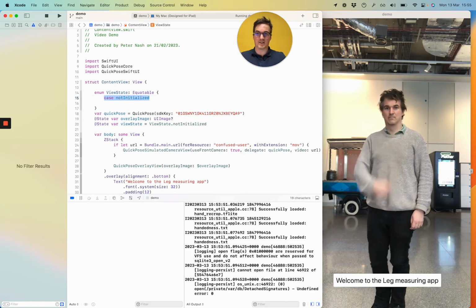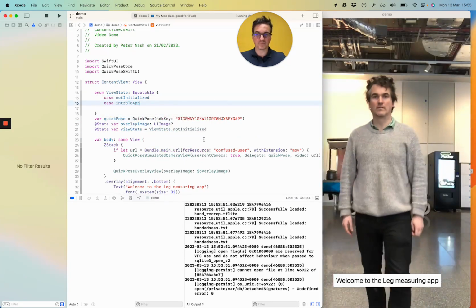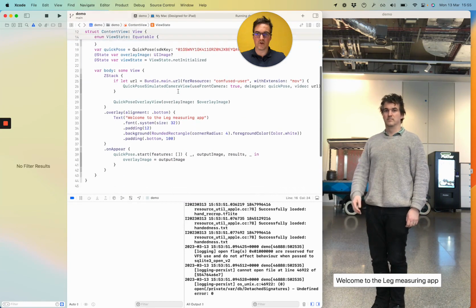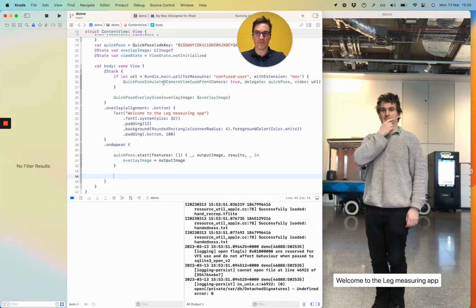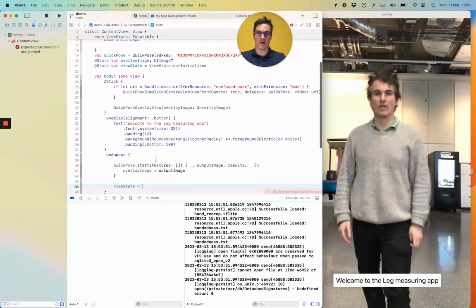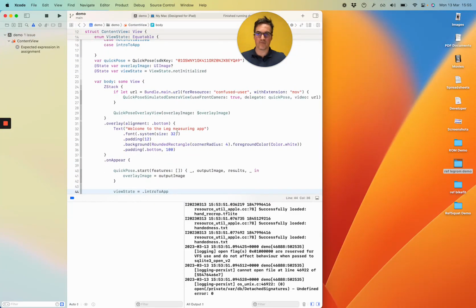And then the next state will be intro to app. So we've got not initialized, we've got intro to app. So when the app appears for the first time, we want the view state to go to welcome to the app. So intro to app. Let's try that.